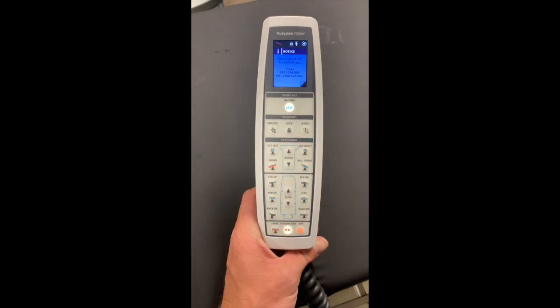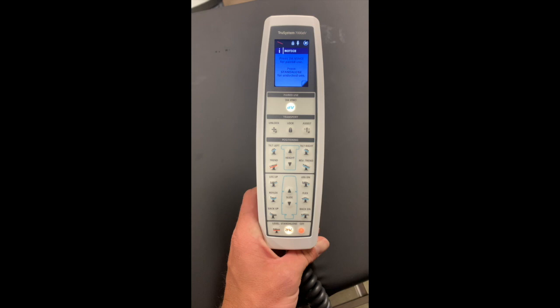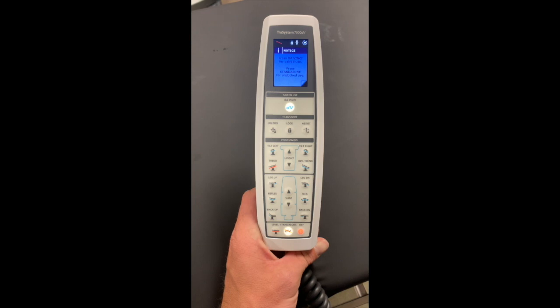In order to pair the robot and the table, you must first turn both on and let them recognize each other, indicated by the DV light illuminating. Note that the table and the robot are still not paired, only recognizing each other at this point, indicated by the DV with a red line through it at the top left of the touchscreen.